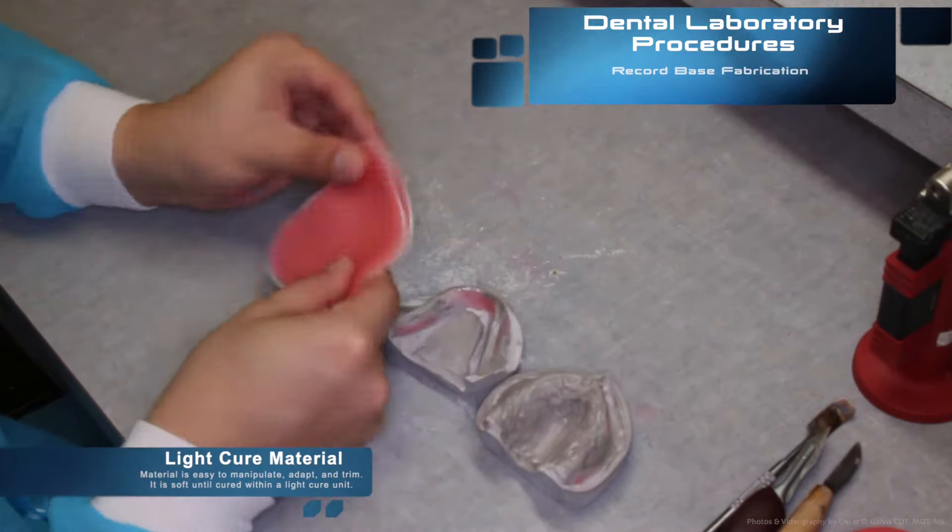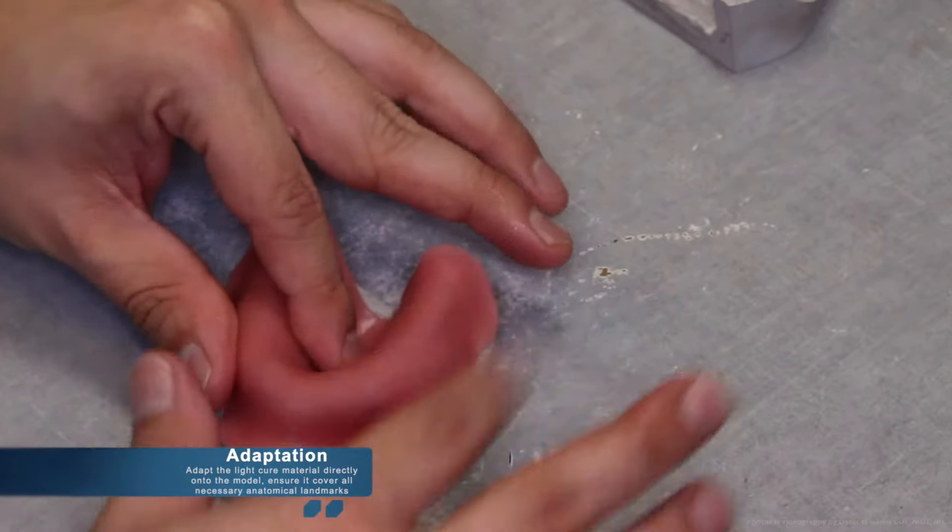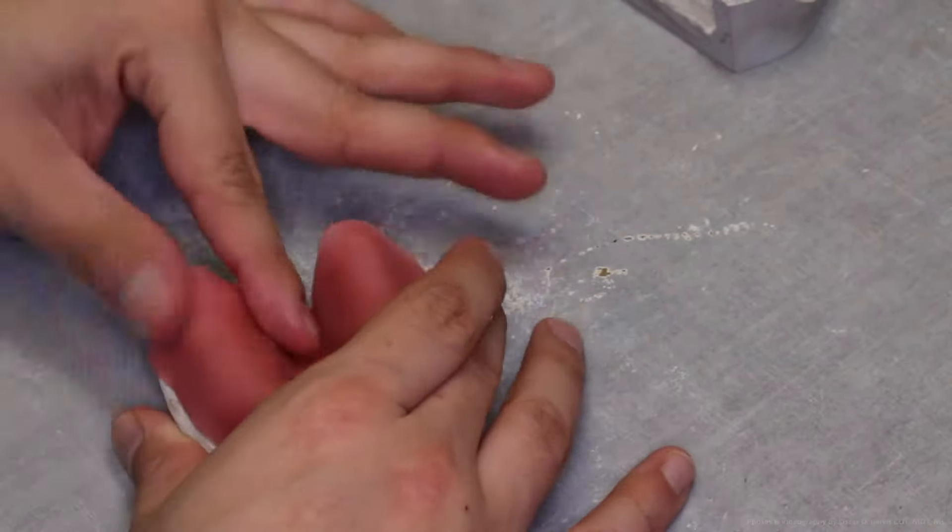Adapt the light cure material directly onto the model, ensuring that it covers all necessary anatomical landmarks. Although this material is the same as the one used for custom tray fabrication, it's important to realize there are big differences: the borders are fully extended on a record base, and a record base does not have a custom tray handle.